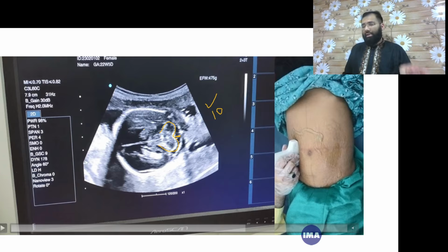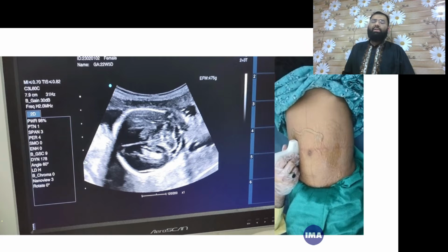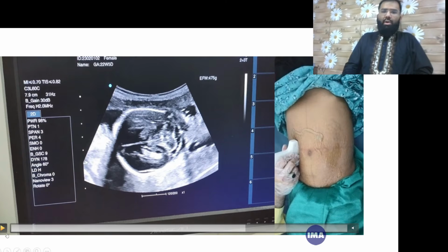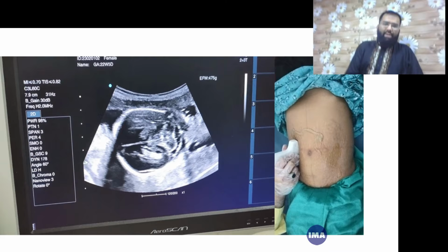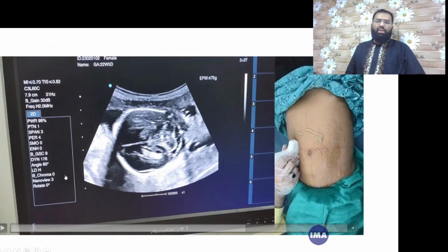If there are any cystic lesions in this region, those should also be seen, especially to diagnose Blake's pouch cyst and such other important pathologies. Cystic dilatation of the fourth ventricle is seen in case of Dandy Walker malformation. All these are important anomalies which should not be missed. Now, most importantly, when it comes to a few other pathologies like vermian hypoplasia, it is one such disease which is diagnosed in late gestation, so this is one which can be missed in earlier scans.